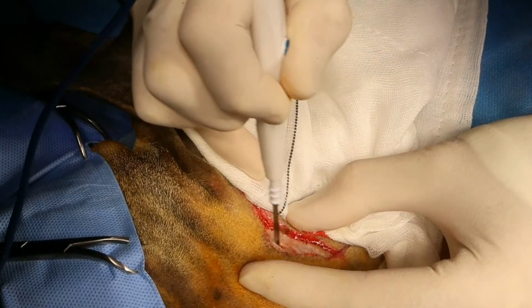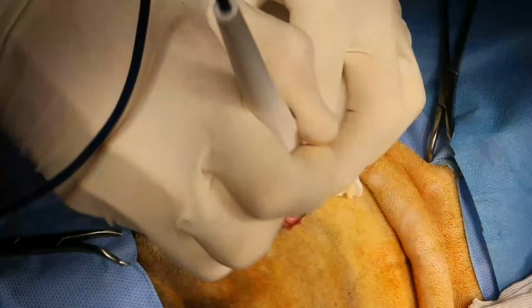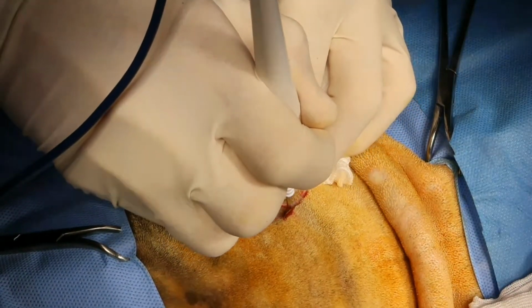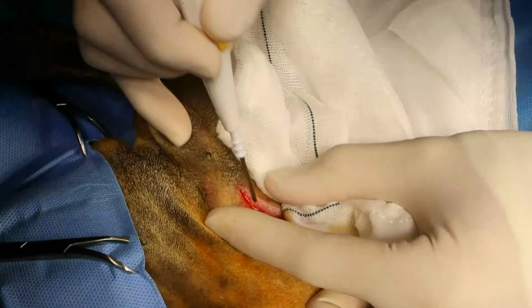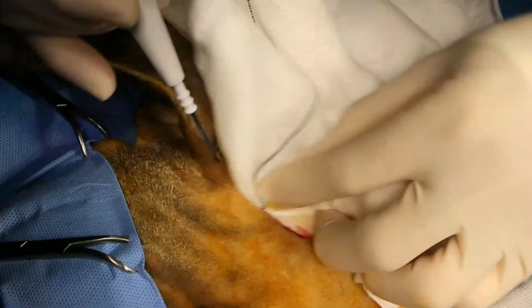Now if I'm concerned about my margins during the surgery, I may do electric chemotherapy. If we send it off and find out that our margins are incomplete, we may come back and do electric chemotherapy later on.